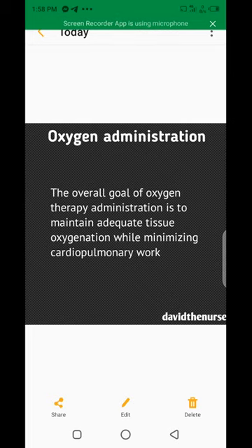Now, when you take vital signs, temperature, pulse, respiration, blood pressure, you can also take the pulse oximetry of the patient to know the oxygen saturation. So any saturation that is going lower than 94, 92%, you know that is a concern, and that patient will probably benefit from oxygen administration.